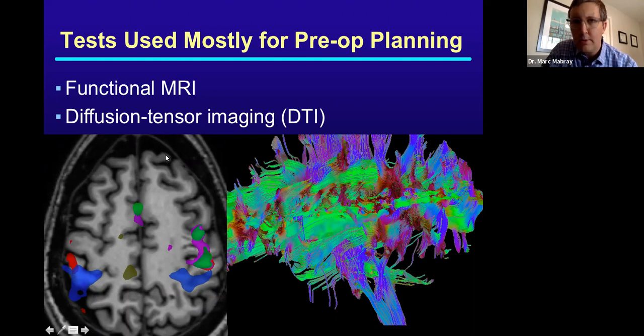So our approach has really been to get all this stuff done beforehand and then send it to the operating room to use, instead of the approach of doing it in the operating room. I should mention that places that are doing intraoperative MRI are not redoing all these fancy sequences at the time of surgery. They're doing more limited structural imaging to check the progress of the surgery.